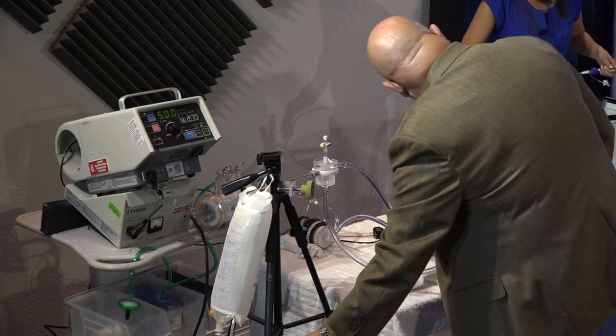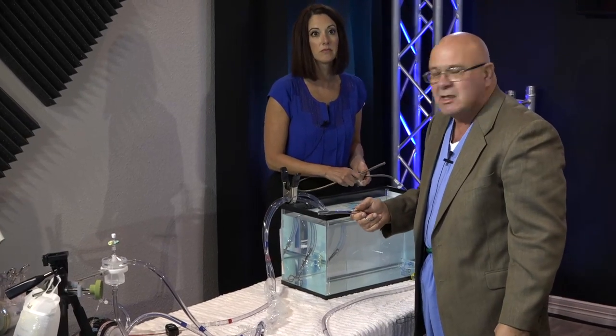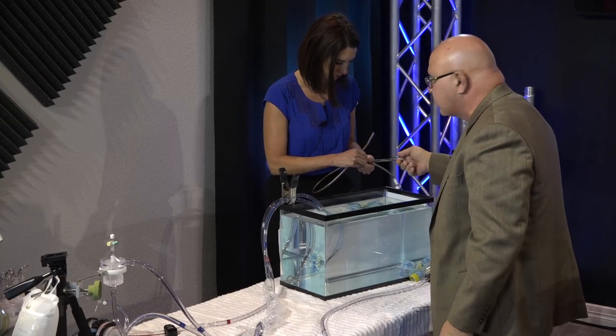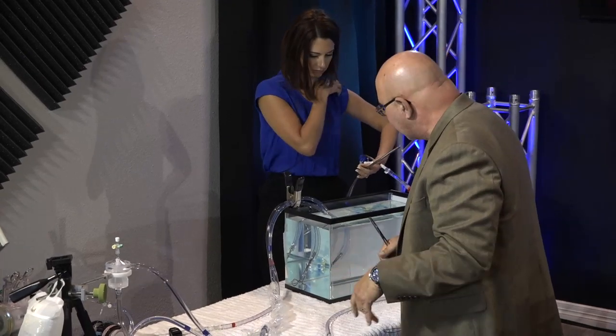Now we also have to prime that thing there, the syringe? We're not gonna prime it. Will it suck the air through? It will not. So don't worry about it. We'll pretend like we did. You put a syringe on there with saline, squirt it, and it goes through. And then you can get the outer sleeve primed as well. But just, again, for deference of time.